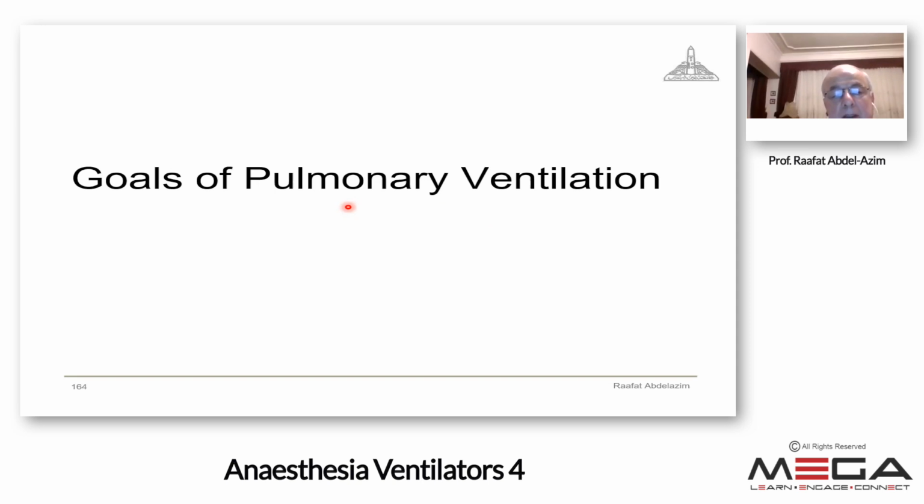So I described how to monitor the mechanically ventilated patient, apart from ABG and other forms of monitoring, how to monitor the patient on the ventilator by observing the numerical display and the graphical display. The graphical display is by 3 types of scalars that are pressure, volume, and flow. And the loops are the relationship between 2 of these variables each time I choose a type of the loop, whether it is pressure volume, pressure flow, or volume flow.